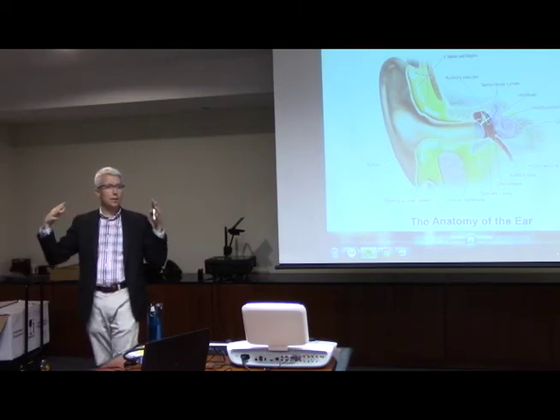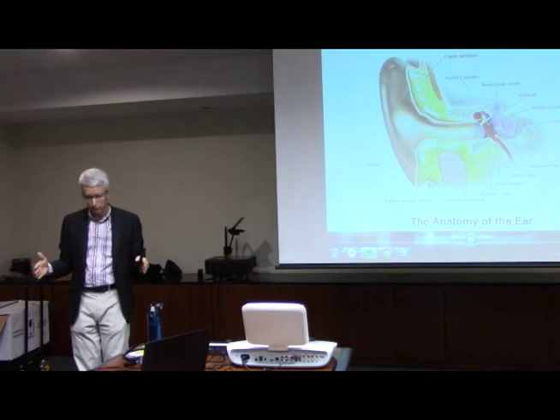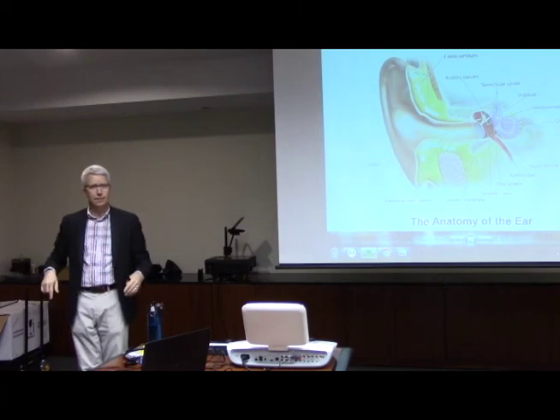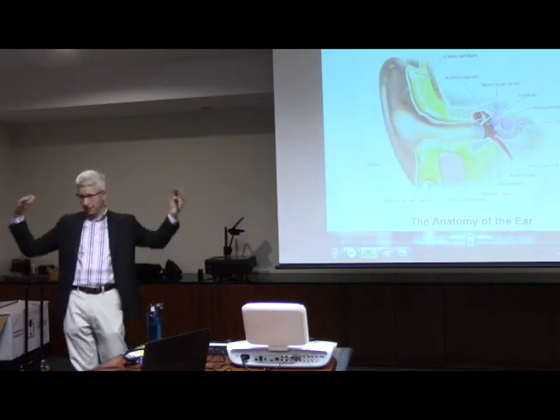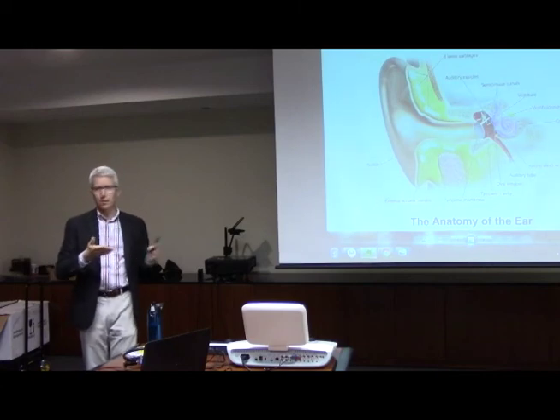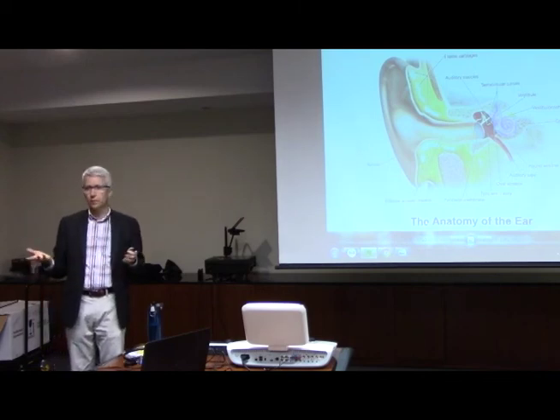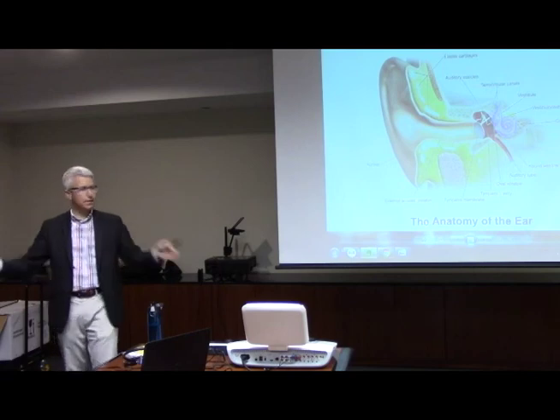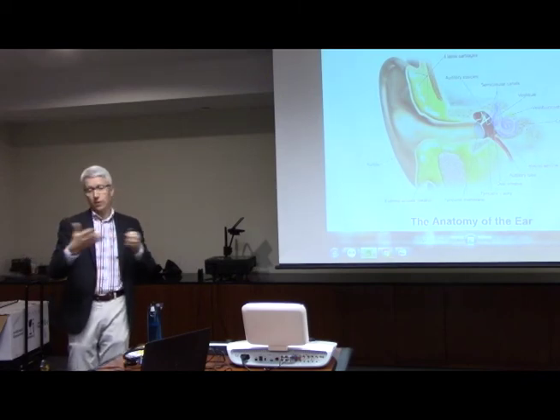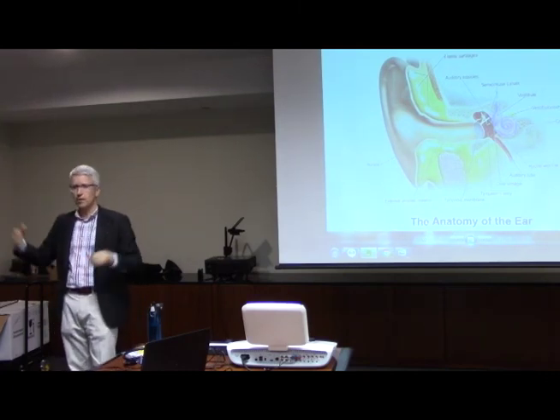These are all usually installed in the sound booth. Sound booths can range from really small, where you sit down and you're lucky if you can move your elbows, like 2 by 2.5 inside, tiny little things which aren't used for kids because there's not enough room for all this other stuff, all the way up to booths we've installed that are probably half the size of this room. In this company, we've probably done something even bigger than that. It just depends on the purpose. But most sound booths have a space on the inside of about 6 foot by 6 foot or 7 foot by 7 foot, which is large enough for the patient, or if it's a kid, the parent, an assistant, plus the speakers and the toys and everything else.